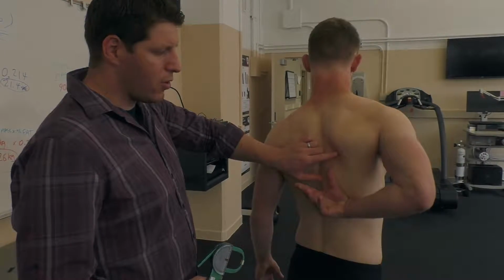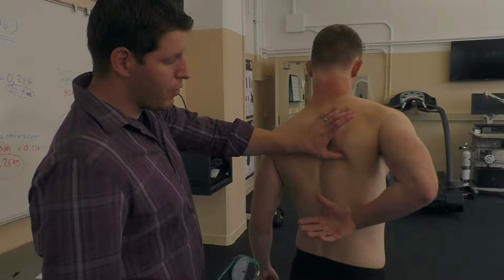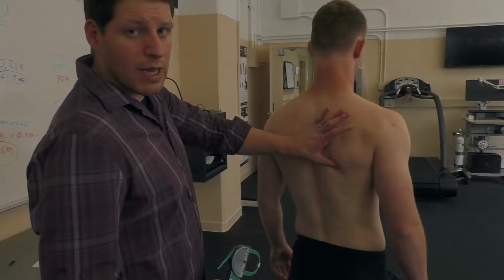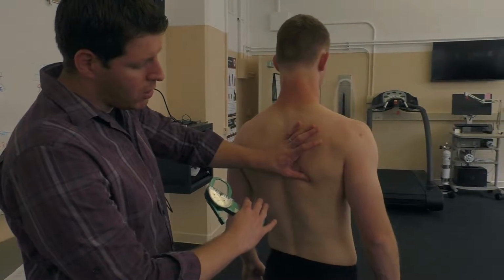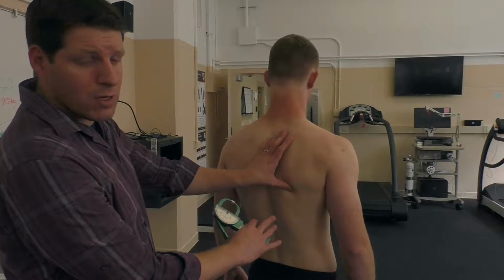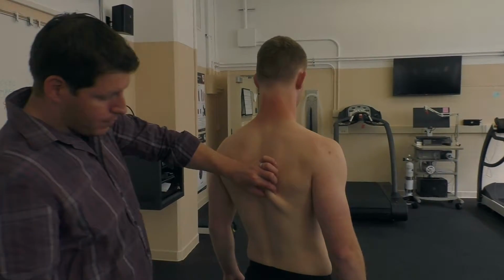There's that inferior angle. Now it's going to slip back when he relaxes his arm. So find it with your thumb, then ask him to relax their arm, okay? And you've got that inferior angle. You know exactly where it is. In this case, the skin fold is about 2 centimeters below that inferior angle. So if my thumb is right below the inferior angle, we know that thumb's about 2 centimeters wide. And there's the fold. And it is a diagonal fold, okay?